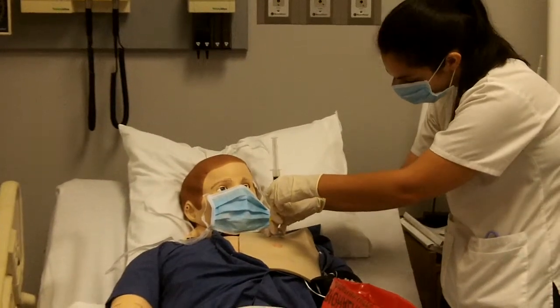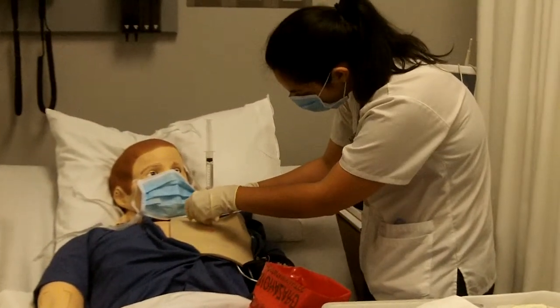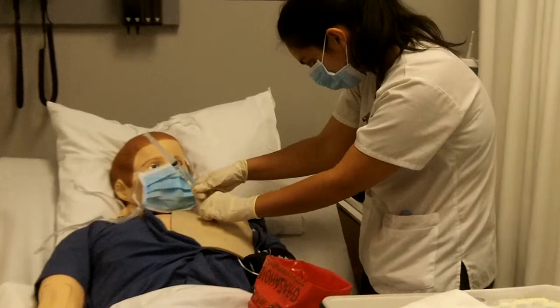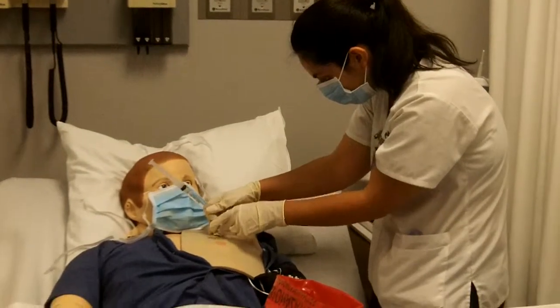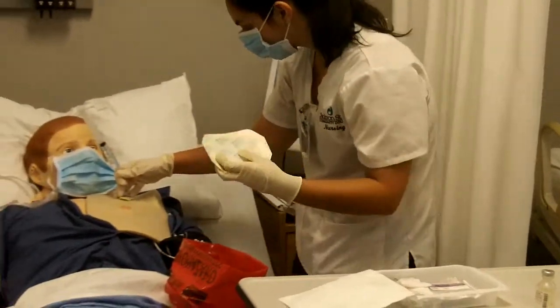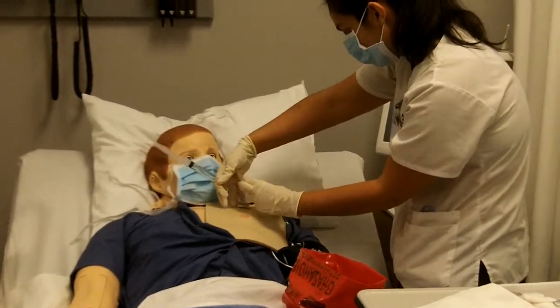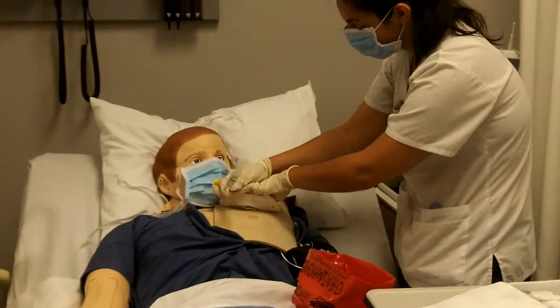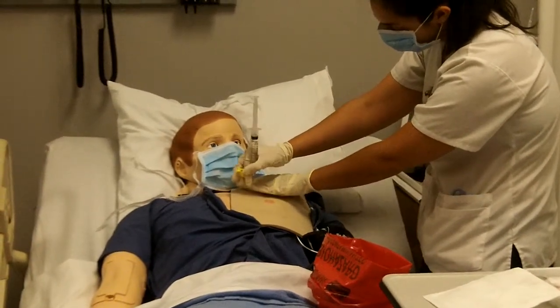And without laying down my syringe, I'm going to grab my bio patch, place it underneath, going to grab my occlusive dressing, making sure my clamp is not underneath it. I'm going to lay it down. And before I lay down my syringe, I'm going to make sure all four corners are covered, and they are.